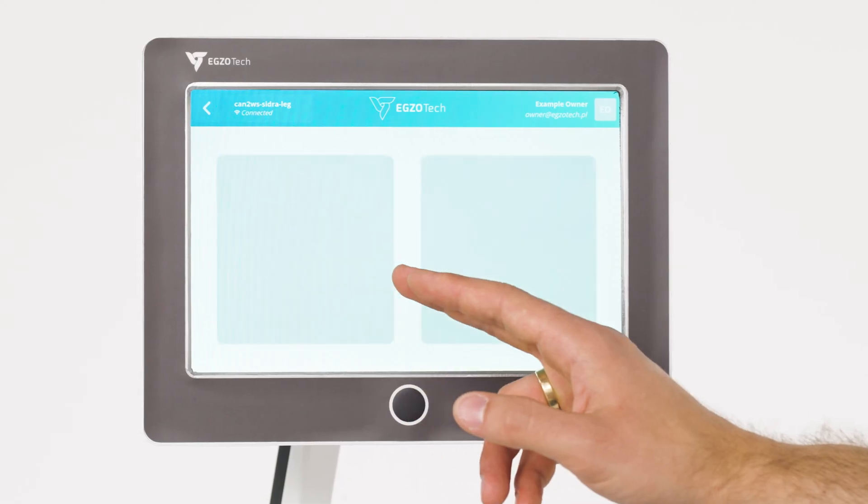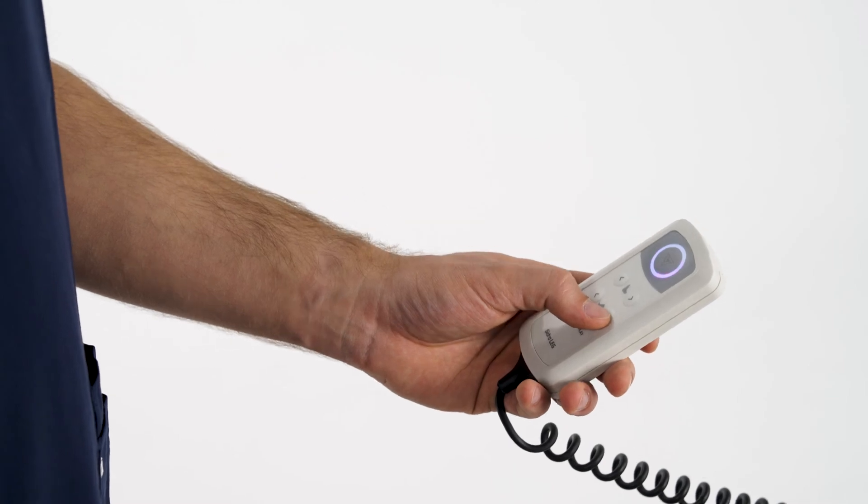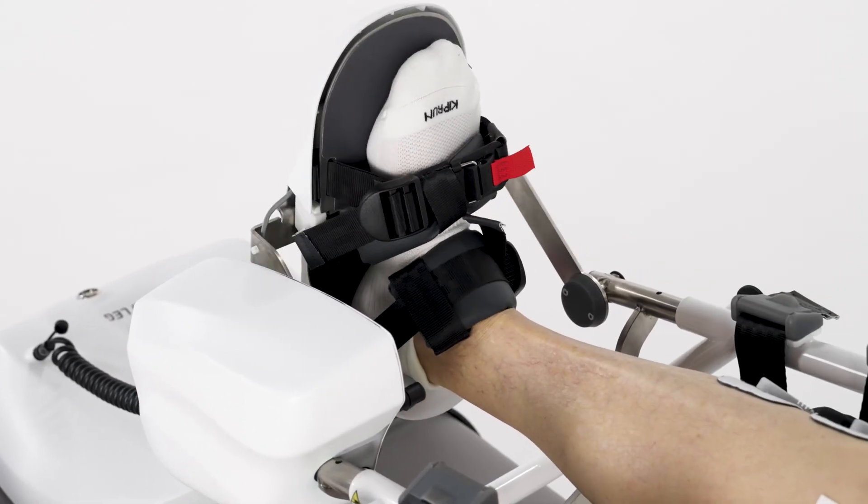Intuitive software speeds up and facilitates the work of physiotherapists. A separate motor allows rehabilitation of the ankle joint or foot drop.